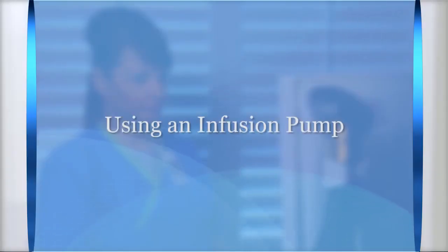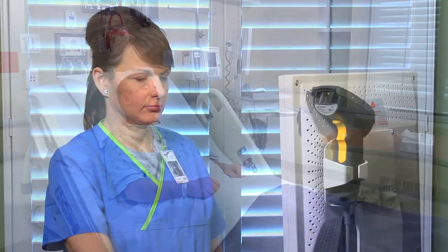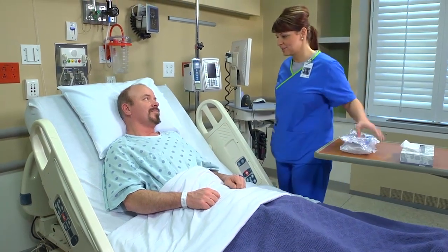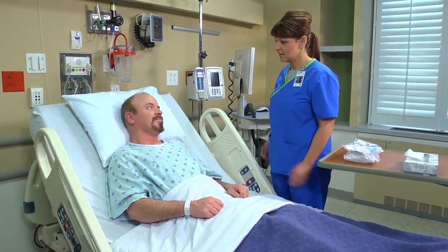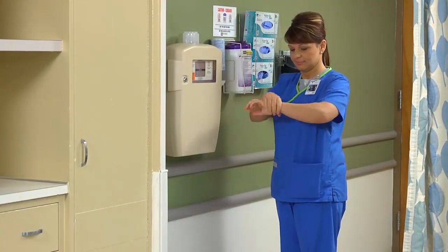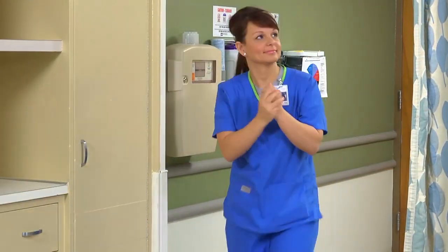To regulate an intravenous infusion using an electronic infusion device, first verify the healthcare provider's orders. Introduce yourself to the patient. Hi, good morning. My name's Jillian. I'll be the nurse taking care of you this morning. I'm going to go wash my hands, okay? Perform hand hygiene and ensure privacy.